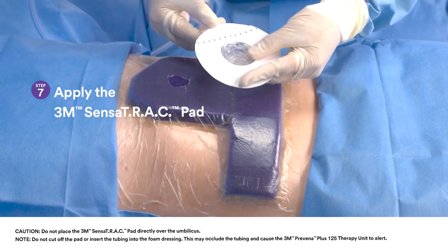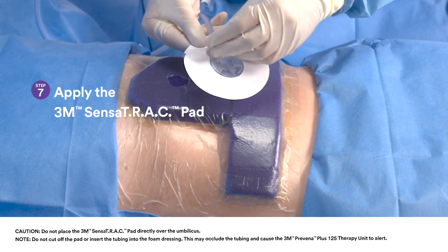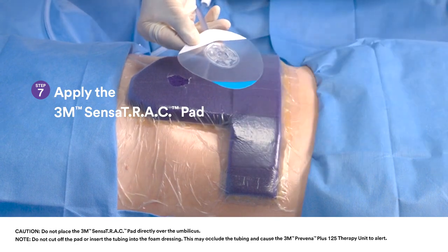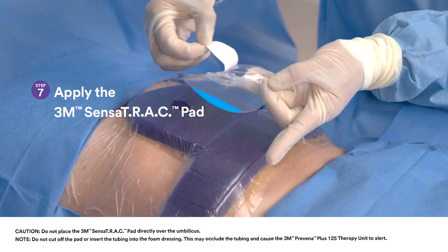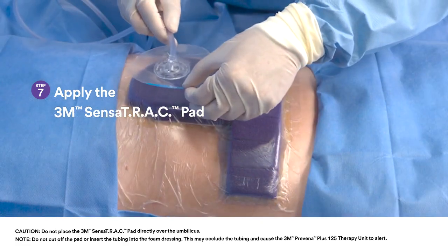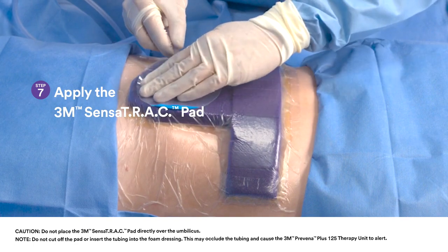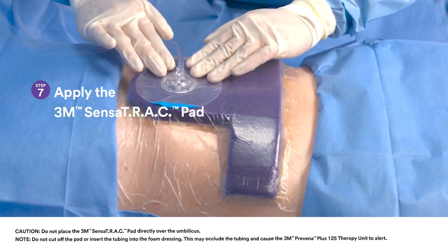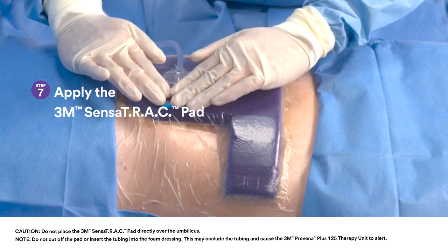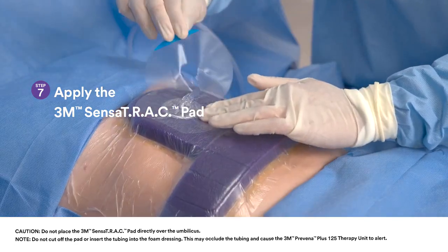Apply pad, which has a central disc and a surrounding outer adhesive skirt. Remove both backing layers 1 and 2 to expose adhesive. Place pad opening in central disc directly over hole in the drape. Apply gentle pressure on the central disc and outer skirt to ensure complete adhesion of the pad. Pull back on blue tab to remove pad stabilization layer.